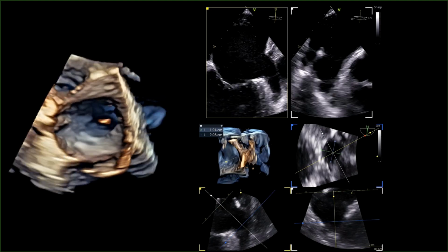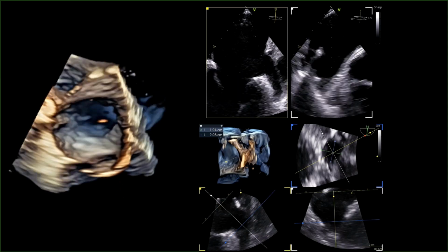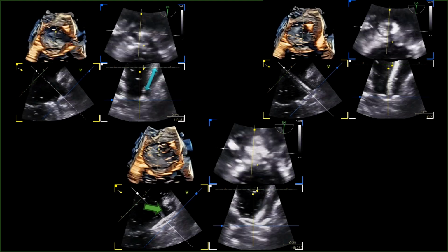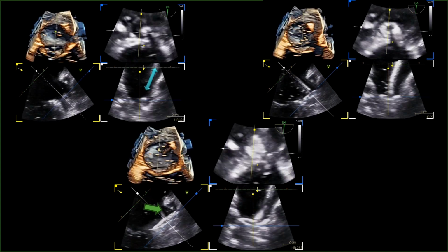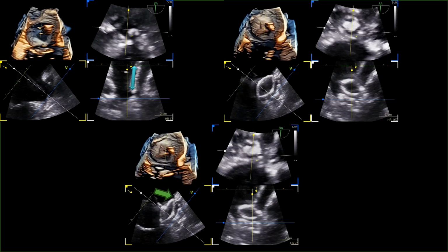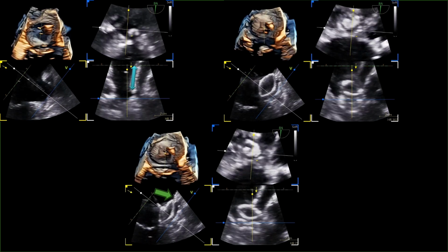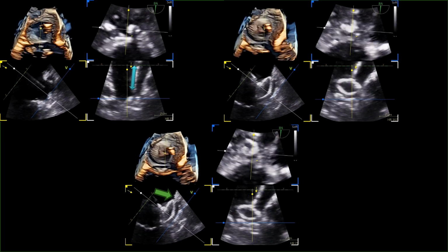In this case, for example, if you see how we made the measurements, the pulmonary ridge was a little bit open, and the mitral valve was a little bit closed. So you can see here that we can also see how the catheter is going in the 135, and here it was not totally coaxial, so you see that we ended with a pulmonary ridge that was not covered. So we just adjusted this catheter, also using the MPR, and you can see here that with this small change in the angulation, we obtain a perfect result in this patient.